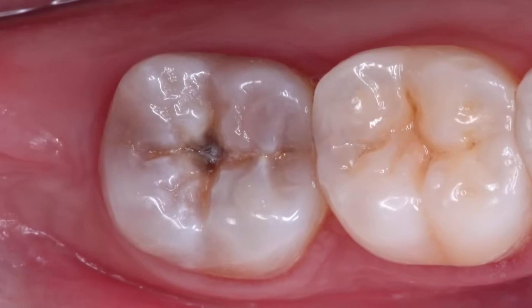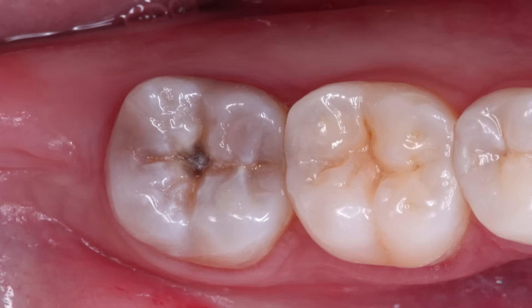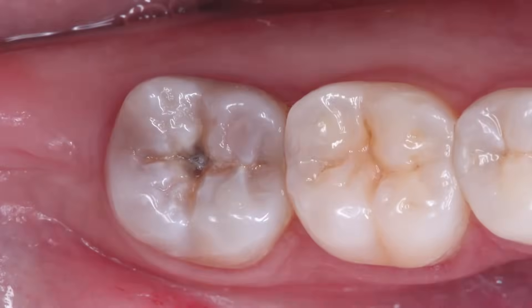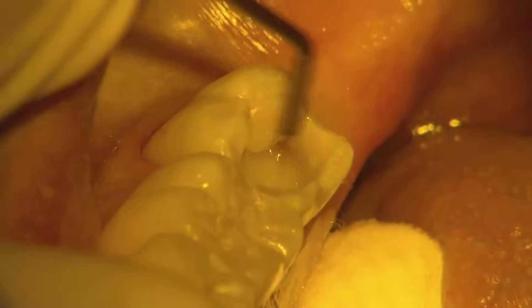For this case we have a patient that has a chief complaint of thermal and pressure sensitivity in the lower right quadrant. Our examination reveals severe occlusal decay on tooth 31. The plan is to perform a caries clean out and a direct composite restoration.